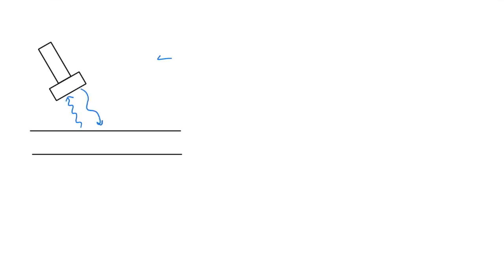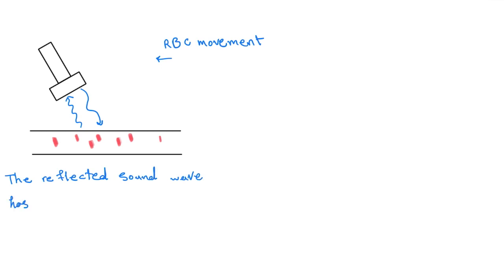Now, in a clinical setting, we can take advantage of the Doppler effect to help us measure blood flow velocity within our blood vessels. Most of the ideas here will remain the same. To measure blood flow velocity, we will need an ultrasound probe, which is able to emit high-frequency waves which will collide against our red blood cells.